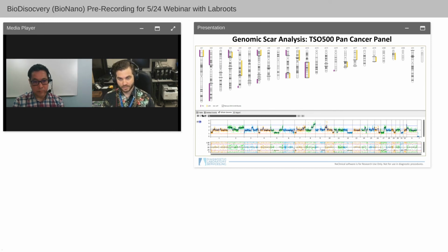It covers when genomic scars are close together. So it's able to omit the small gaps from being counted, according to the rule that they need to be a certain 3 megabases apart. And it does a comprehensive way of evaluating aneuploidy and other mechanisms that will also be ruled out of calling homologous repair deficiency criteria that we didn't really touch on.